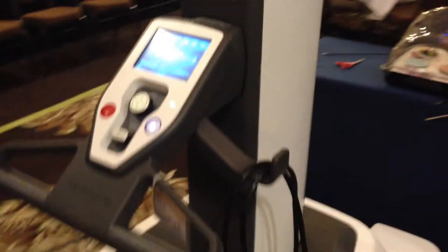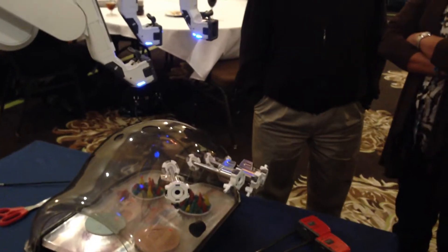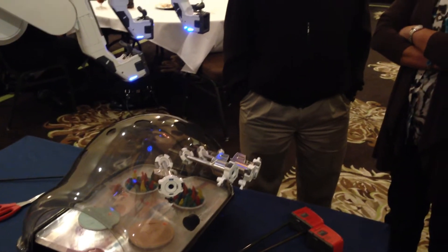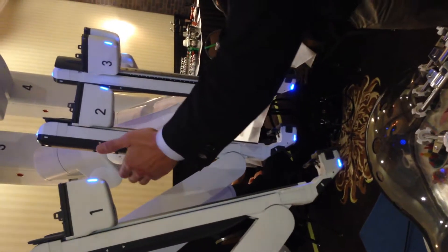As you can see, the arms are smaller and thinner. It minimizes the ability to have those collisions that you'd have in a colorectal procedure and having to refine the docking. The docking is going to be a lot more streamlined — it is a more forgiving mechanism.